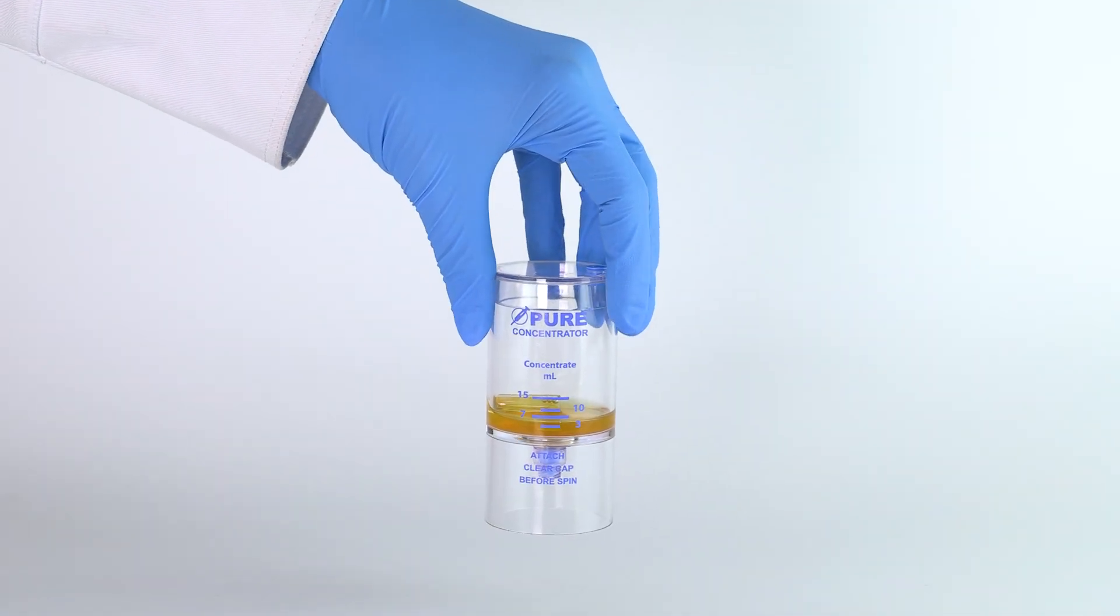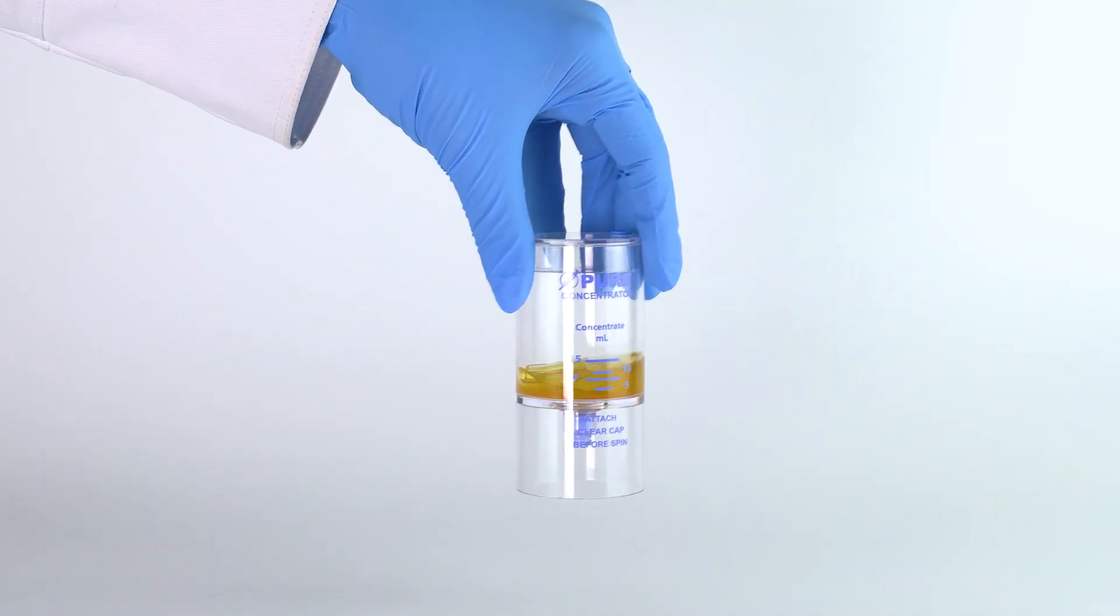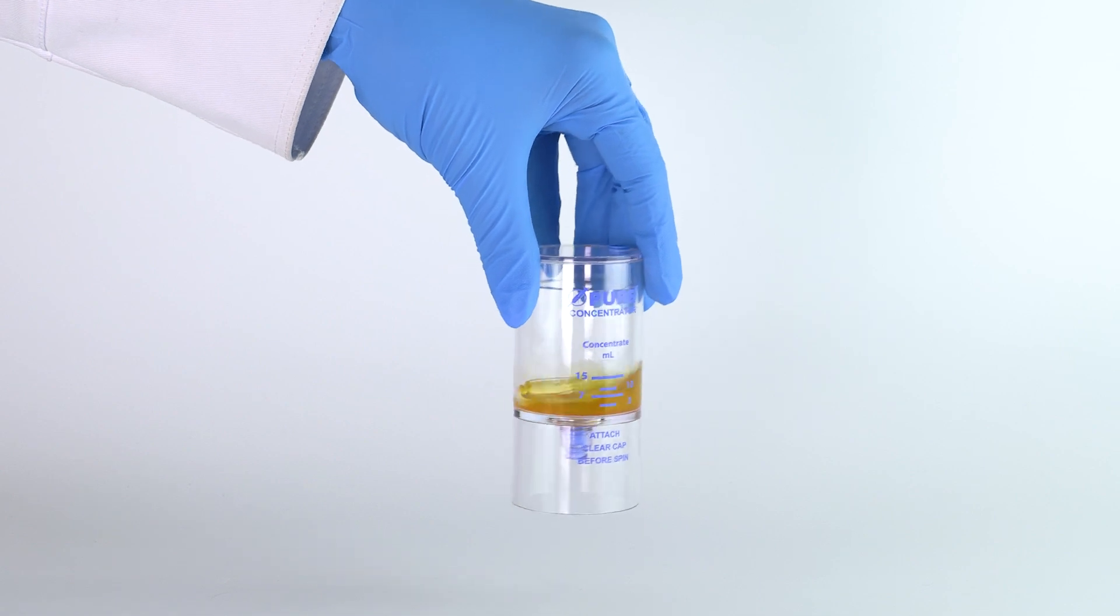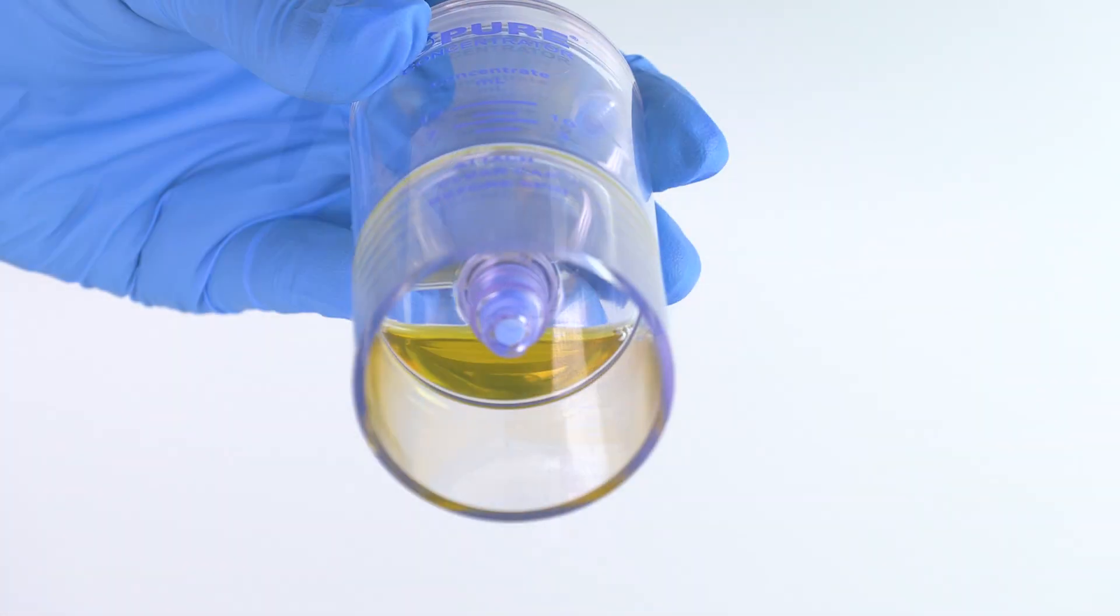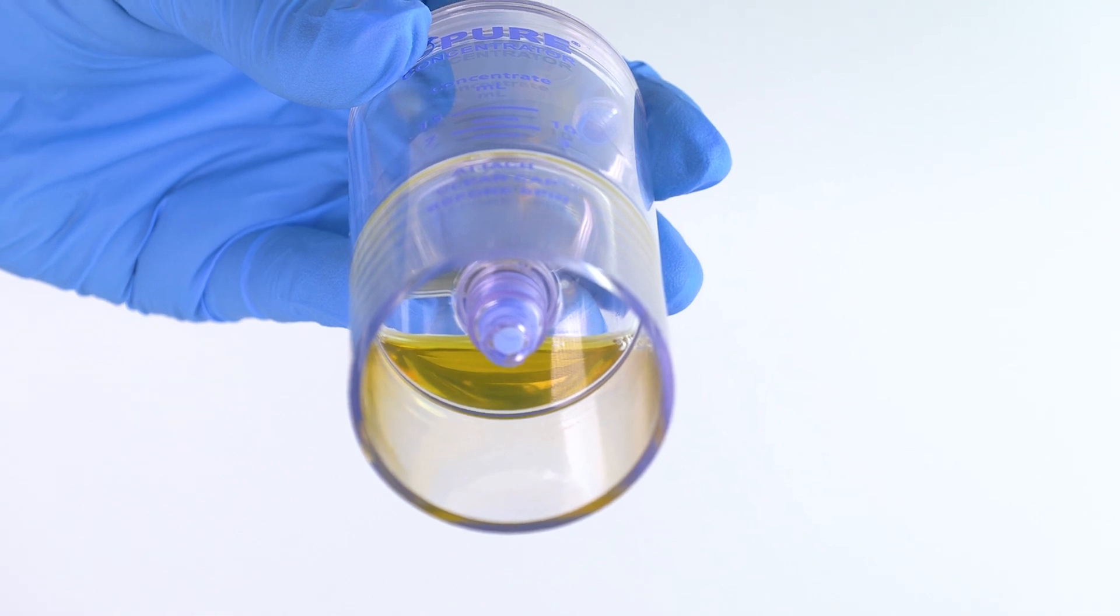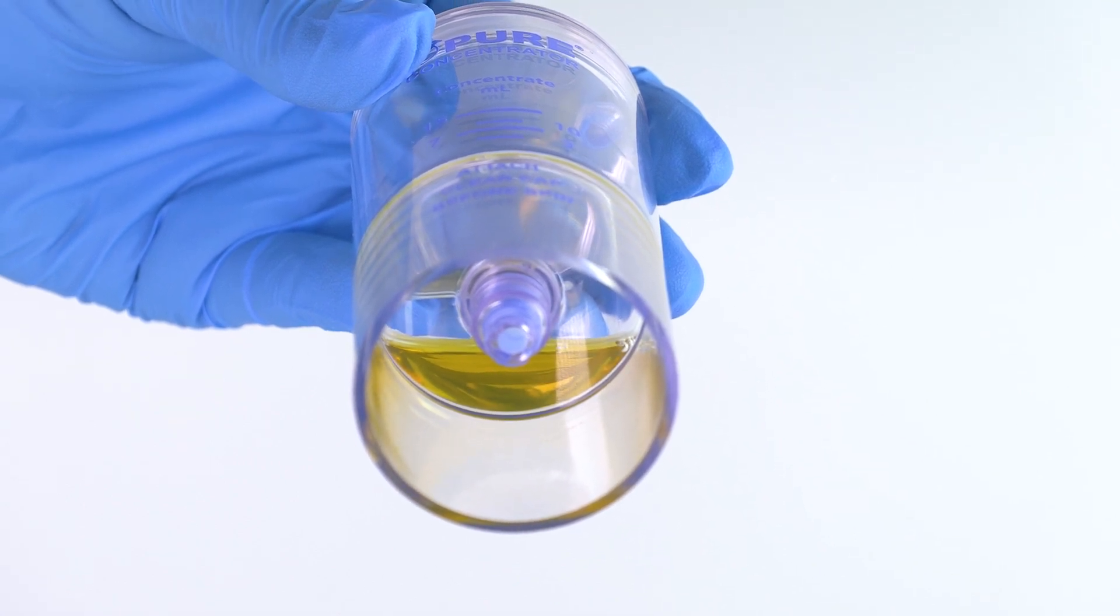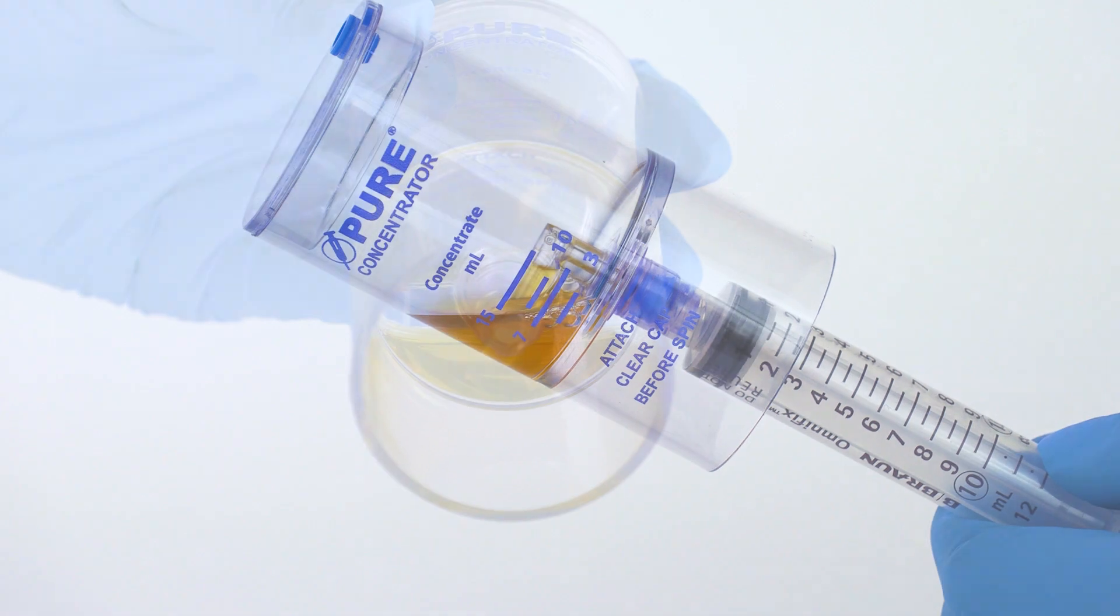Re-suspend the platelet buffy coat back into the plasma by rocking and swirling the device back and forth. Do this until all of the platelets have been re-suspended into the plasma solution and is no longer visible at the bottom of the device.